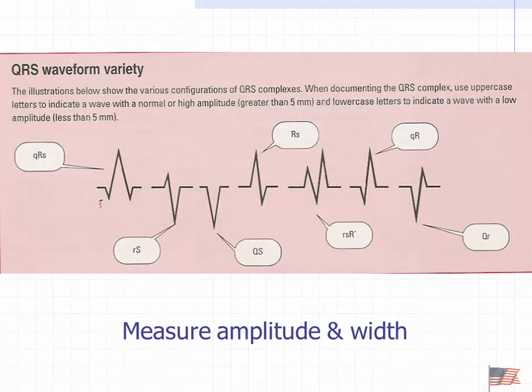The first positive deflection after the PR interval is called the R wave. And we're talking about going from baseline, up or down, back to baseline.